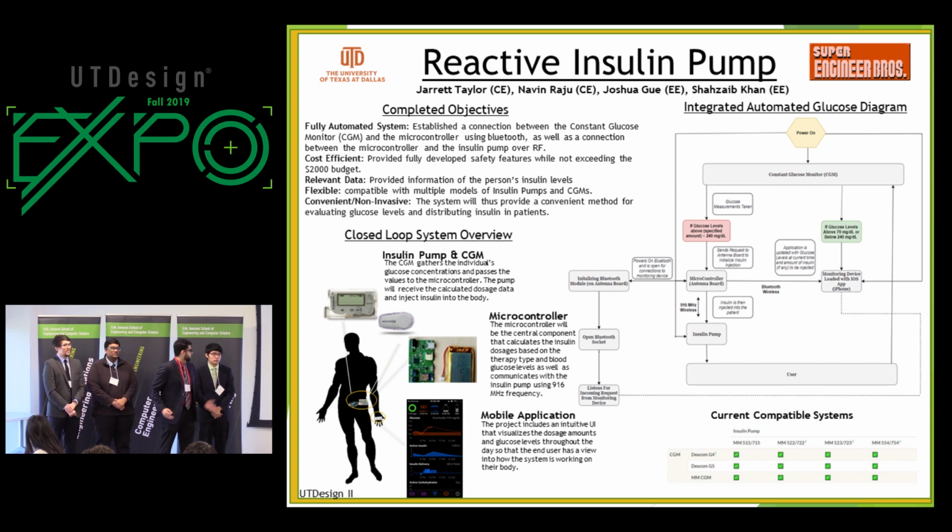So the challenge here was the insulin pump that we have is an industry standard insulin pump. When we went over to Medtronic to get some help on our project, they basically said, no, we can't help you, you're on your own. We're not giving you any trade secrets. So the main challenge was reverse engineering the insulin pump, figuring out what frequencies the insulin pump was actually sending out. And to do that, we did a lot of very unconventional methods, such as reaching out to ex-employees and different documentations. It worked.